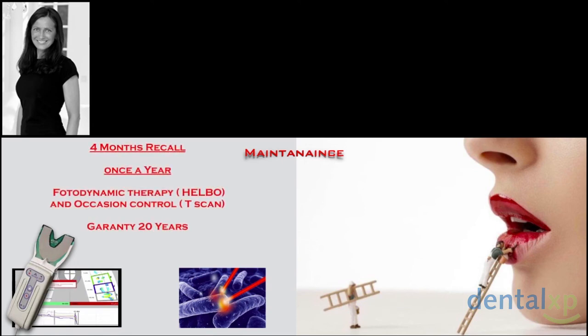we do an occlusion control with a T-scan, which is the most precise nowadays, as far as I know, and a decontamination. Why is it important? Why am I secure in doing this? Because I can see every 4 months a mucositis. A mucositis I can treat immediately, locally and generally, but a peri-implantitis not. So that's why it's a win-win procedure, and I can give that long-term guarantee to the patient.